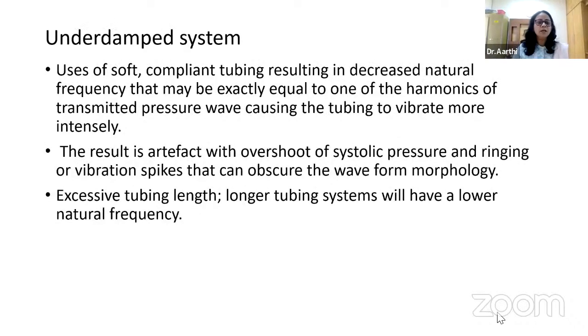Coming to the underdamped system, the cause could be compliant tubing, where the natural frequency is exactly equal to the signals transmitted by the arterial system, and this usually results in overshoot of the systolic pressures, causing vibration and spikes.